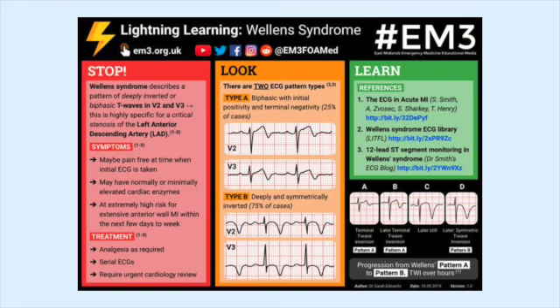All right, let's talk about Wellens. I've actually had one case of Wellens. I pulled this up for you if you want it. That'd be great. So, Wellens syndrome, when you bring it up or find it, sometimes the cardiologists are less than impressed, but it's actually very interesting. It really is kind of specific, or they say it's specific, for a high-grade lesion at the top of the LAD. Sorry if this is creepy, but I'm learning, because I don't know anything about Wellens.